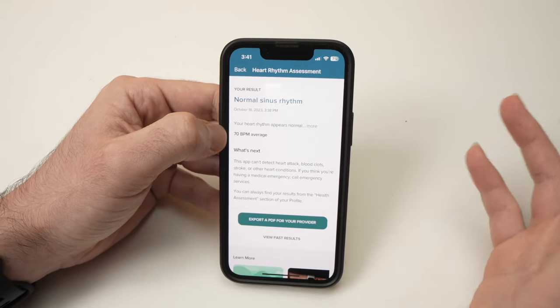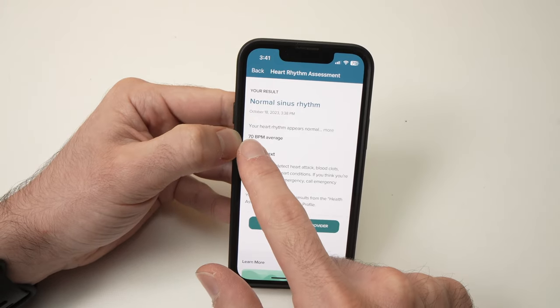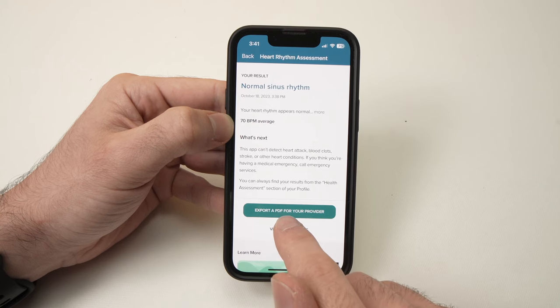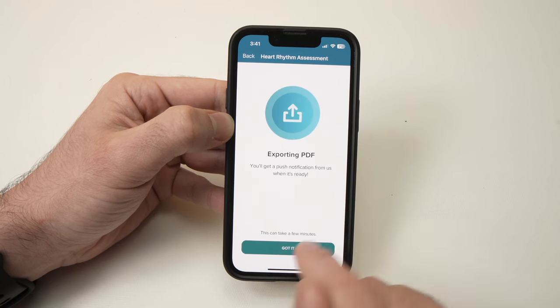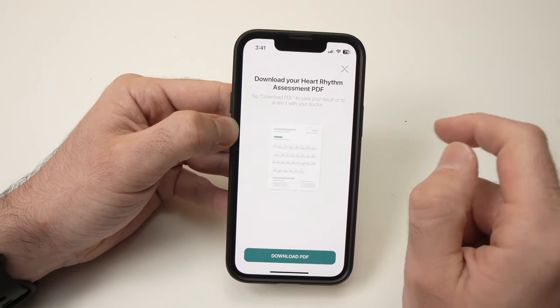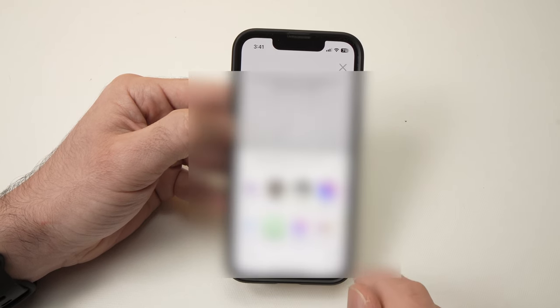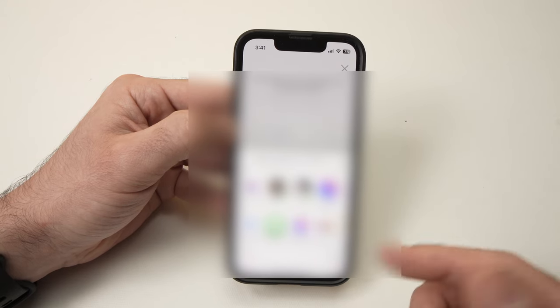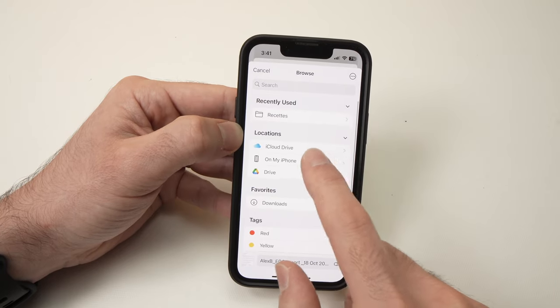You can share the results with your healthcare provider so they can analyze it, since you probably won't know what to do with the raw data. You'll also see the average beats per minute. Press Export a PDF for your provider, then press Got It, tap the top, then Download PDF. You'll be able to share it via email or save it to your phone.